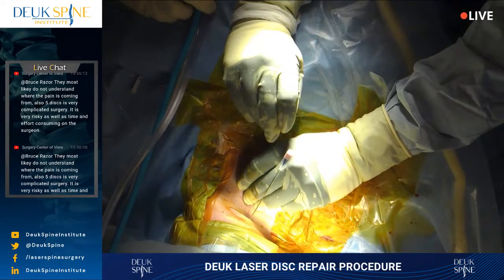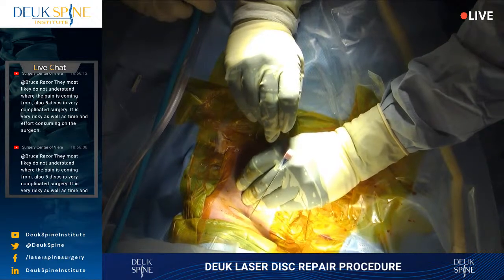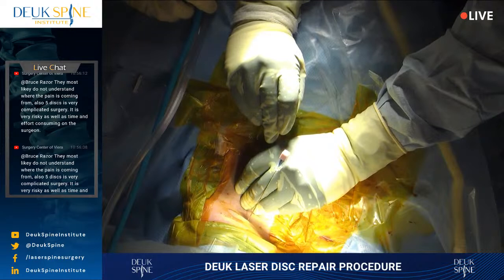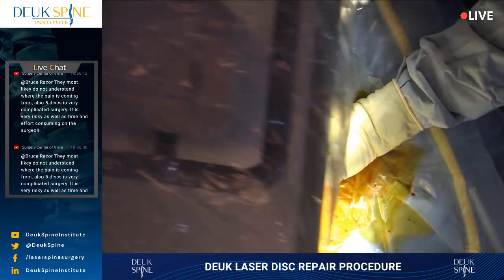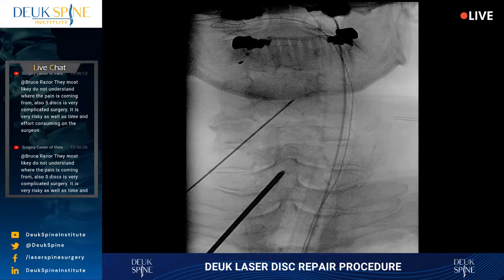All right, so I got to come back up. There we go, right there, shot. What? No, you don't need to. Shot. Who is that, Rita? Shot. That's perfect. Give me an AP quick. Nobody move. Hurry up. Perfect, lateral.